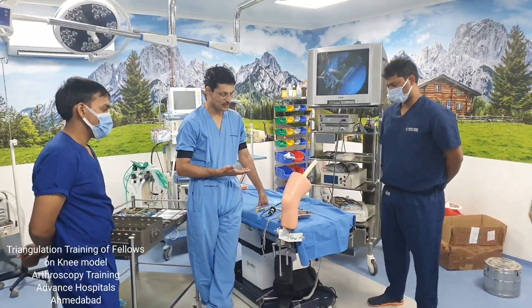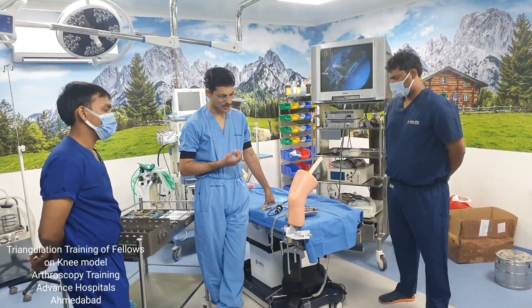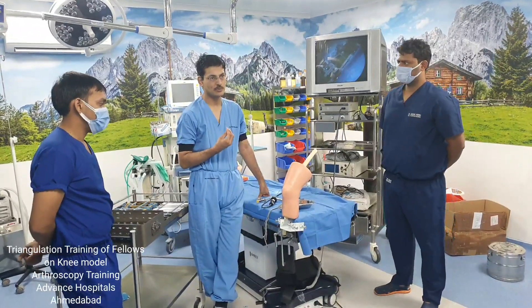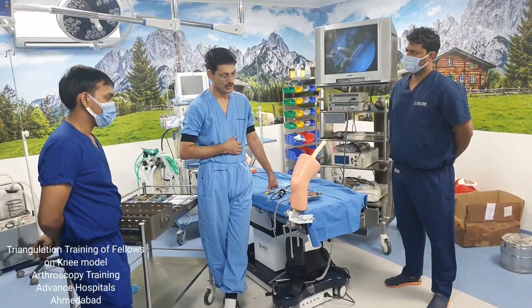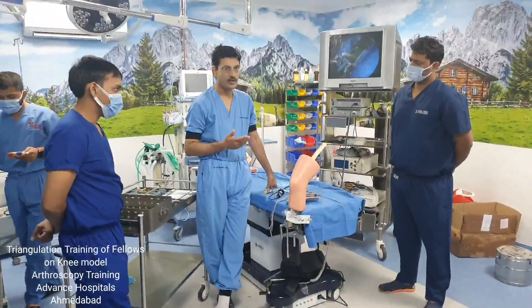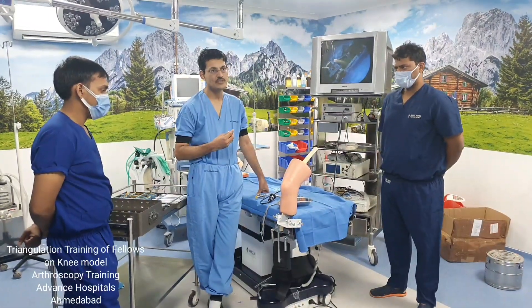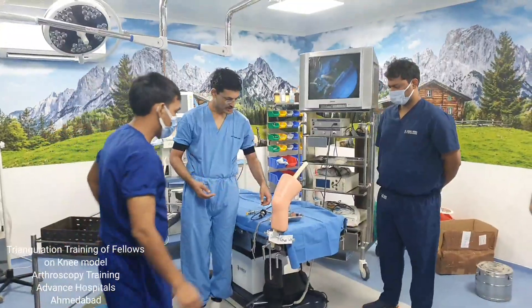We will be doing this kind of a demo presentation. This presentation originated because many fellows were complaining that they are not getting adequate hands-on exposure, and it is usually difficult to give hands-on exposure to fellows during live surgeries. So we have developed this model to teach them how to do triangulation and how to orient themselves to do an arthroscopic surgery.